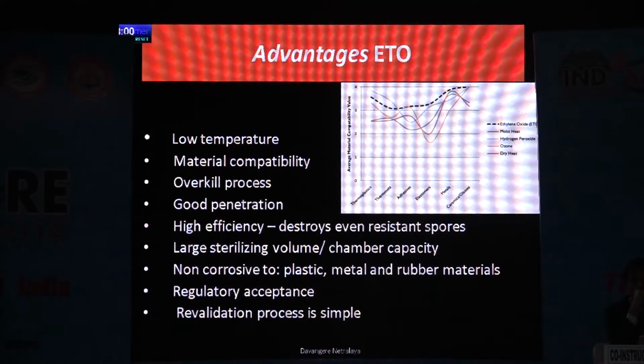So what are the advantages? As I told, it's a low temperature sterilization. Material compatibility is very well maintained. It's also an overkill process. You can be rest assured that the sterilization process is complete. It has very good penetration, highly efficient.